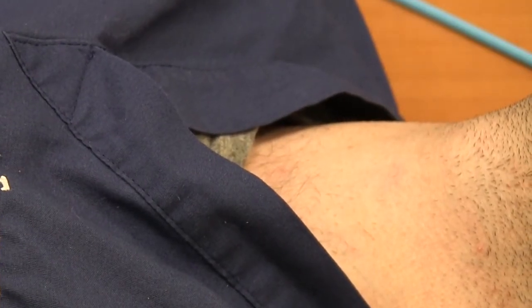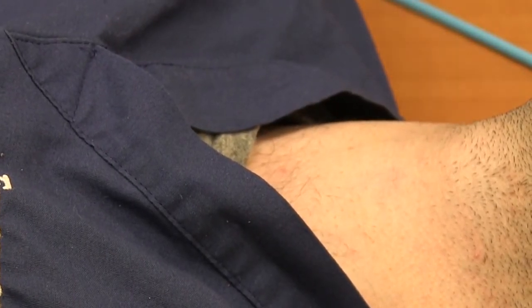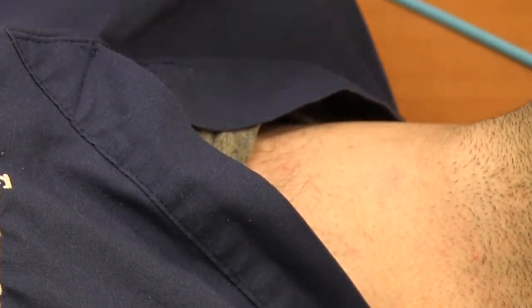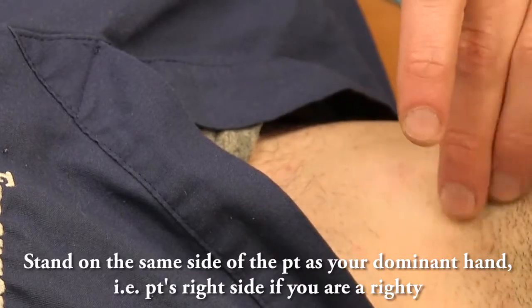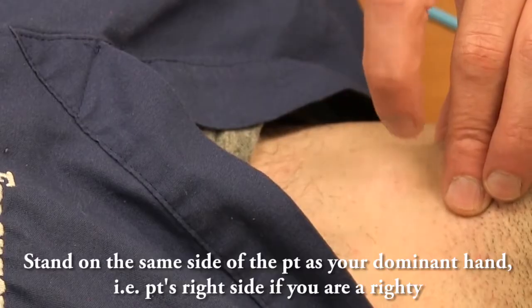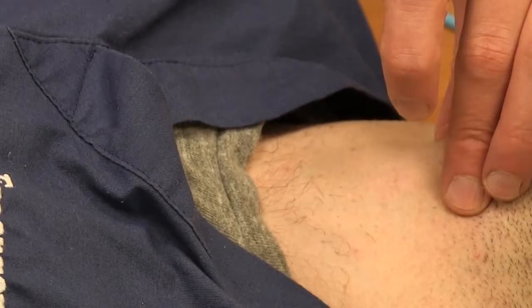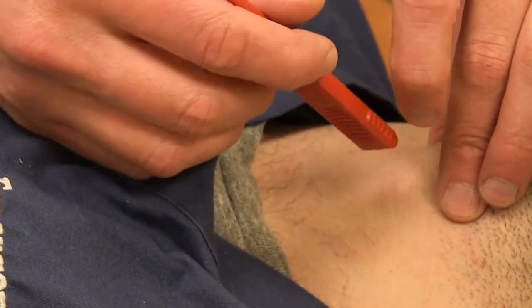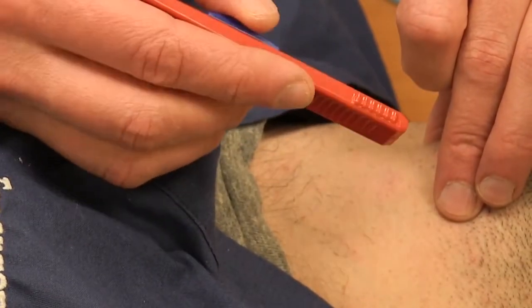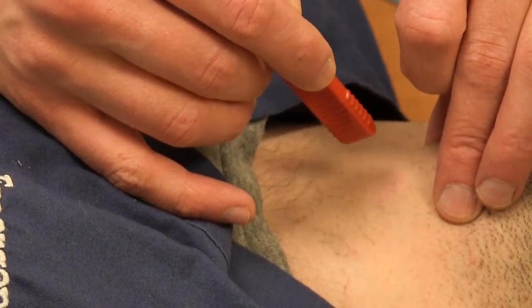Here's the actual procedure, and it really matters where you put your hands — my friend Richard Levitan talks about this. Your non-dominant hand goes and actually holds between your thumb and middle finger the thyroid cartilage, which leaves your index finger free for palpation. The scalpel would be in your dominant hand, held as if you know how to hold the scalpel, with your hypothenar eminence resting on the chest of the patient.